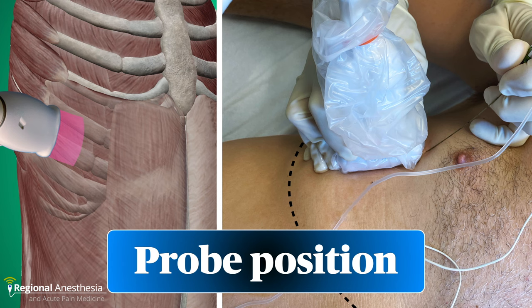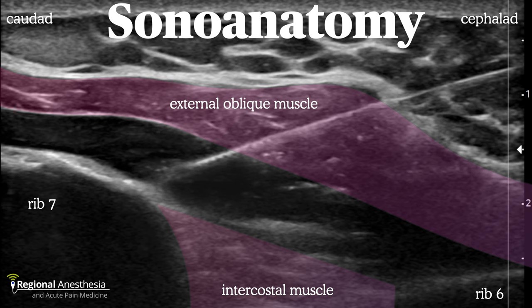To perform this block, a linear probe is placed on the chest wall just medial to the anterior axillary line over the 6th rib, parasagittal in orientation. The needle is advanced from cephalad to caudad. Here's a typical picture with that probe position. We see the 6th and 7th ribs and an intercostal muscle between them. The external oblique muscle is the only structure superficial to the chest wall here, and we see that an injection of local has lifted that muscle up off the ribs.